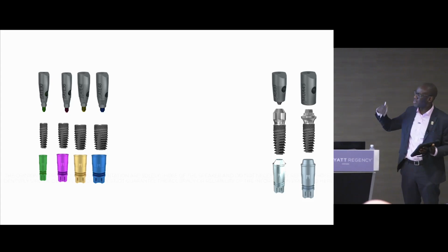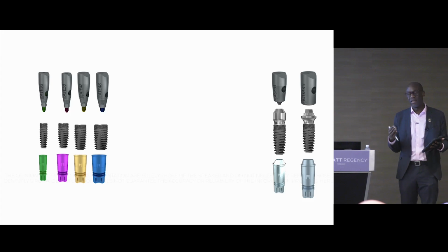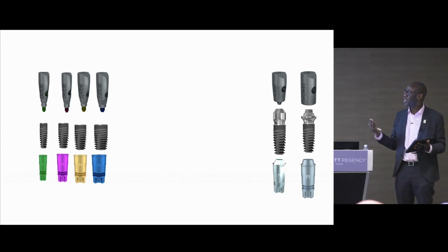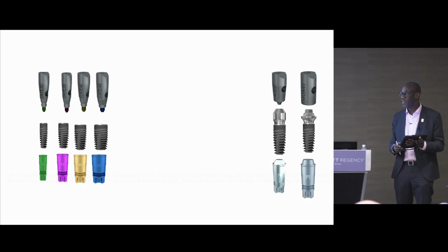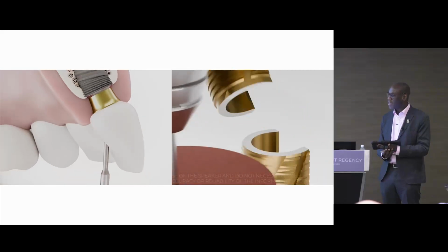This is an implant system. It's not relevant for today's talk, but there's all of the different scan body sizes. There's also multi-unit abutment scan bodies that are available. So there's a fully digital workflow with the Elos components. And that's where this fits in.